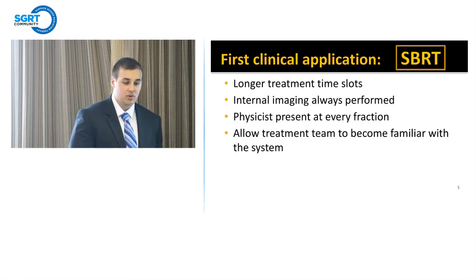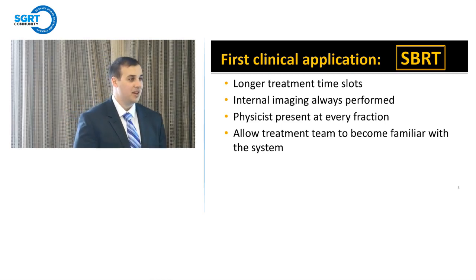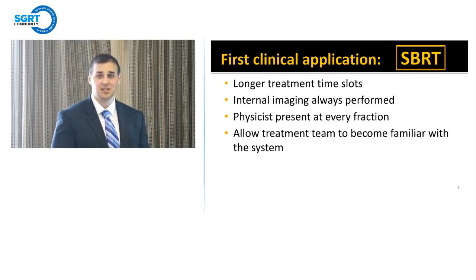And so AlignRT has often been used to set up left-sided DIBH breast patients, but we currently at our institution do all those patients on our Trilogy. So as this is only on our TrueBeam, we had to find another alternative as to what we could use its implementation for. And so we do treat a lot of SBRT cases on our TrueBeam, and that was what we decided to go with.